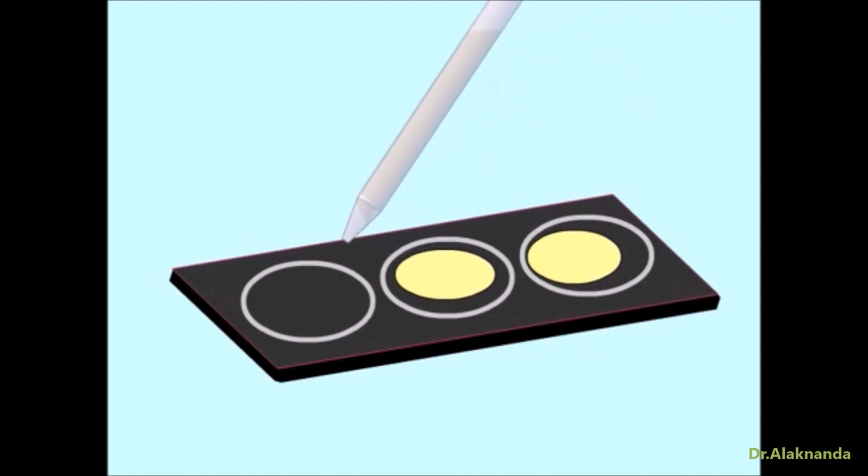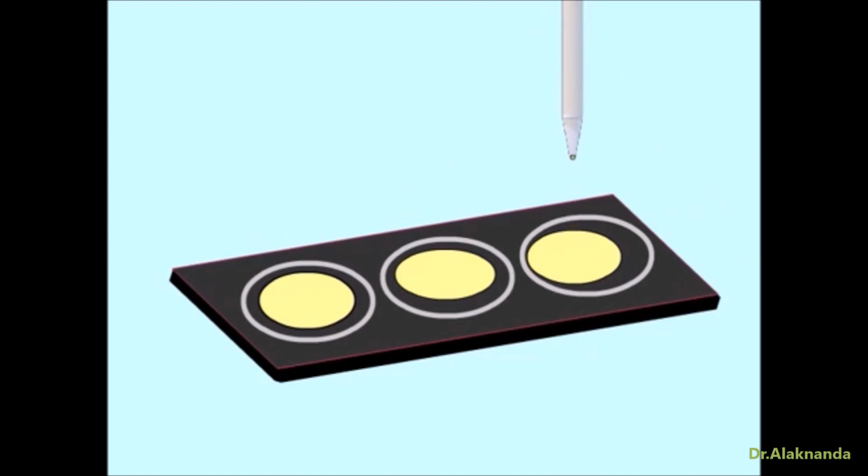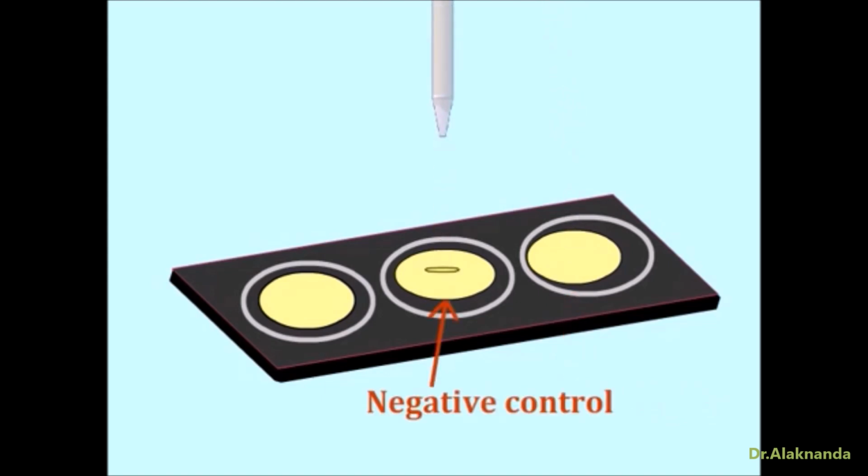of the coated latex beads to each of the 3 encircled areas on the slide. Note that the suspension is concentrated enough to produce a milky appearance on the background. Now you add a few drops of the unknown sample that you're interested in testing, but you will also need to use one circled area for a negative control solution that contains no antigen, and another for a positive control solution that contains the antigen of interest.